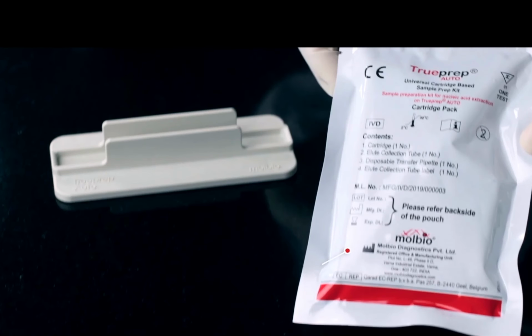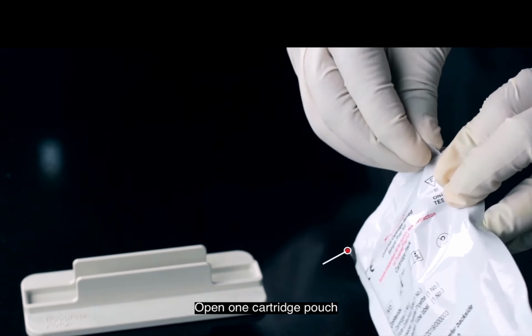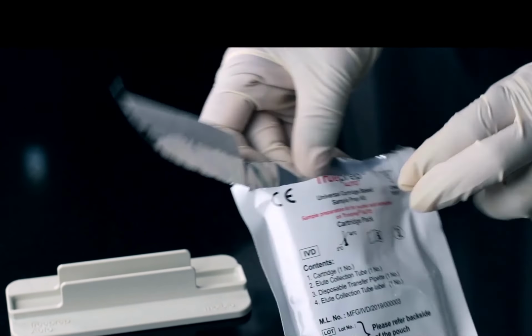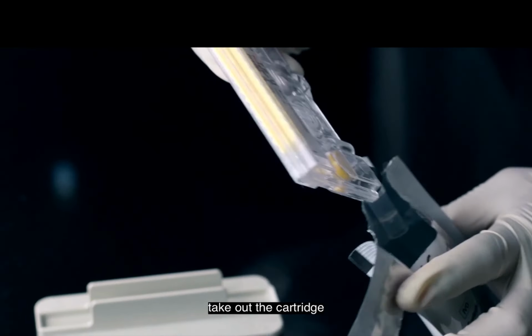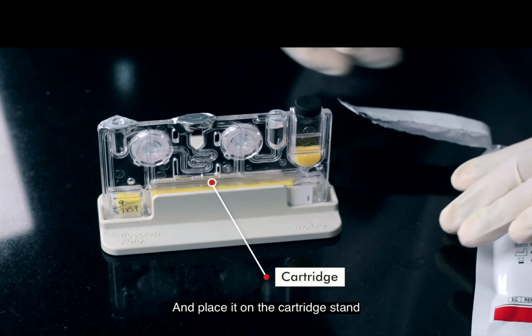So cartridge-based DNA extraction, this is our cartridge pouch and that is the cartridge stand. So you open the pouch. So here is your cartridge. Okay, place it on the stand. So on the right side, you can see there is a black stopper. That is where the sample is inoculated. And you can see this yellow color sponge is there.